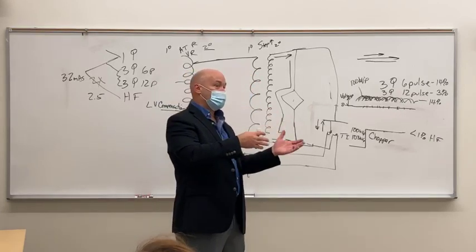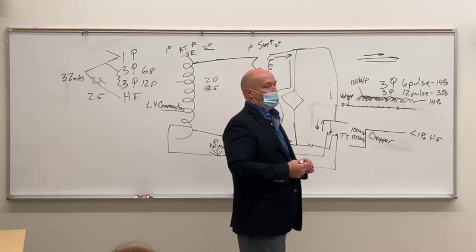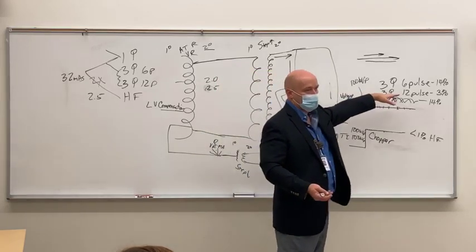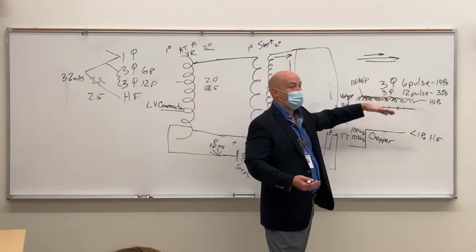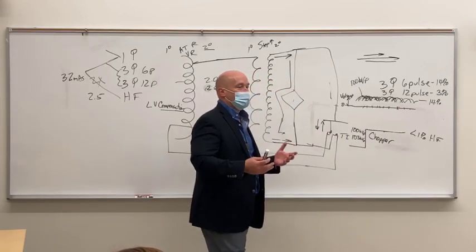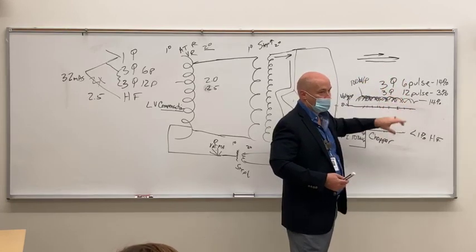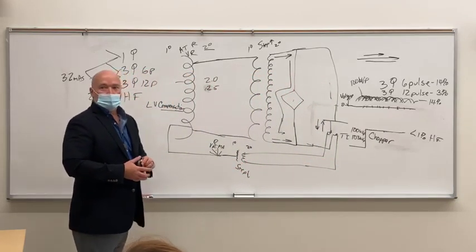No, the 3-phase 6 pulse to the 3-phase 12 pulse, effectively there's not any change. There's a slight increase. So if you knew that you had 3-phase 6 pulse, then you might get to that 30% if you went from 3-phase 6 pulse to high frequency. So really there's not any technique adjustment between either 3-phase and high frequency, or certainly between 3-phase 6 pulse and 3-phase 12 pulse. Okay. Anything else?